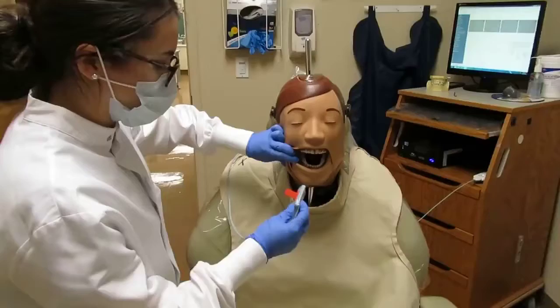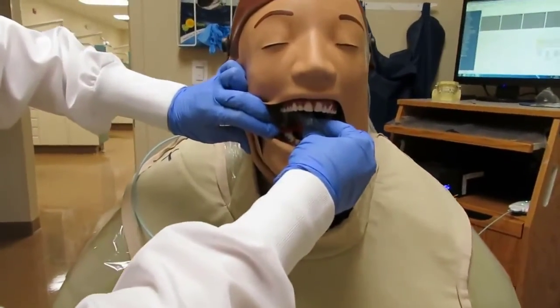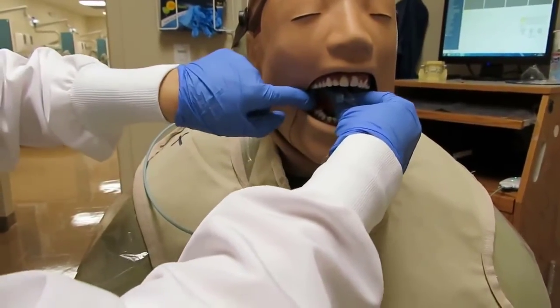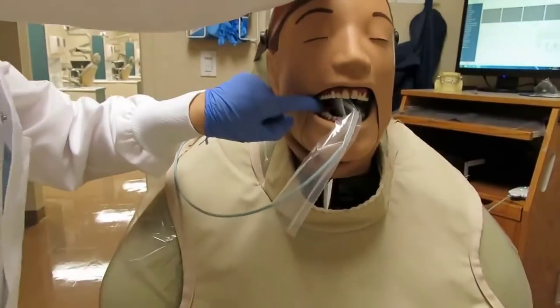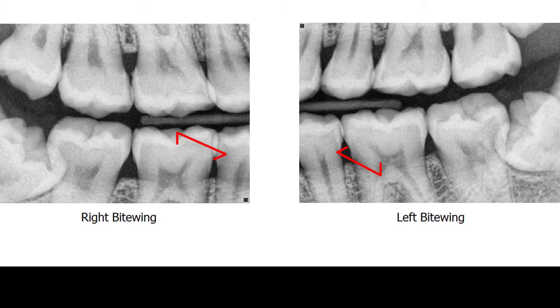For the molar exposure, the receptor is placed further posterior, centered over the present molars, while making sure the front edge of the receptor is aligned with the midline of the mandibular second premolar, because we want to see the distal aspect of the mandibular second premolar on this image.